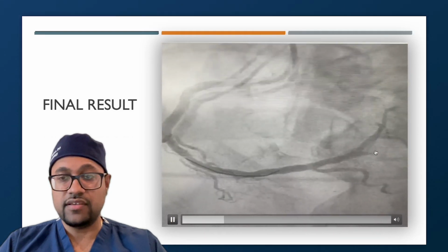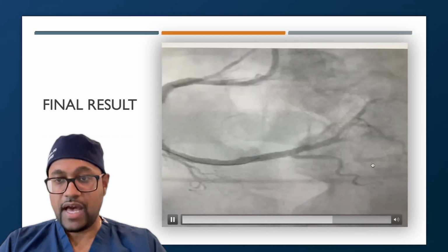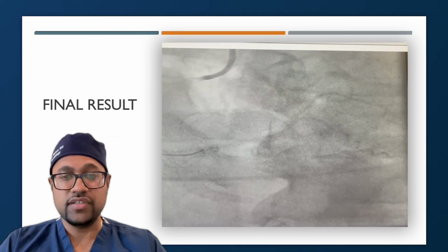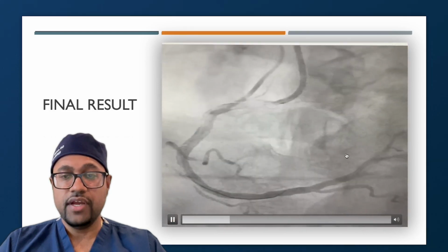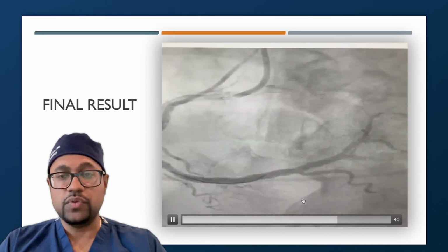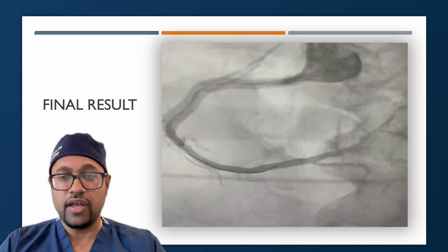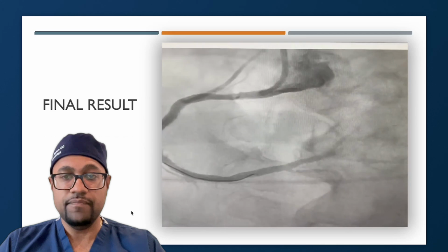I did notice that I had a little bit of distal clot embolization to one of the blood vessels down in the very bottom of the RCA that I'm going to leave alone and probably just treat with glycoprotein 2B3A agents like Aggrastat or Integrilin to kind of marinate and dissolve that clot over the rest of the day. The patient's loaded with antiplatelets. I think in this case, we used a medicine called prasugrel that basically inhibits the P2Y12 receptor of the platelet to stop further aggregation of platelets, and also to protect that fresh drug-eluting stent we just put in.